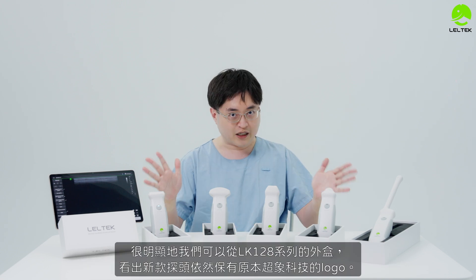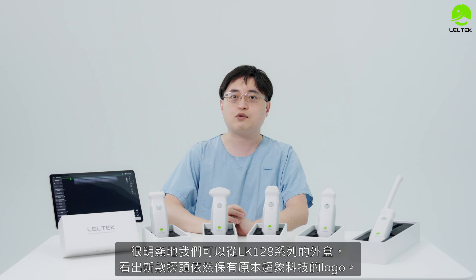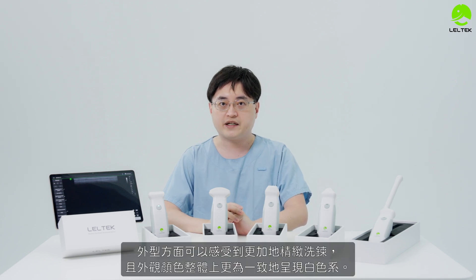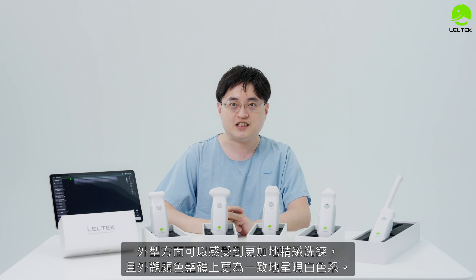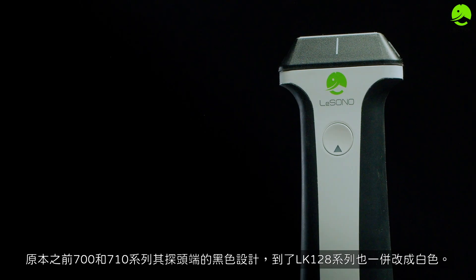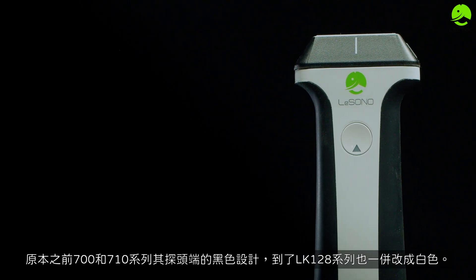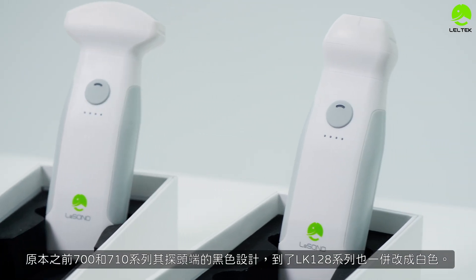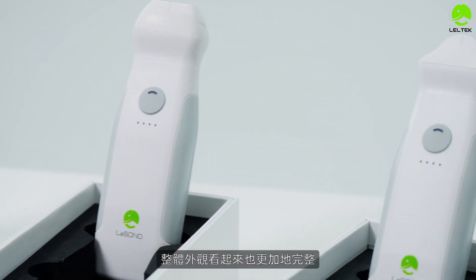The layout and look of the LK-128 series has its own distinct profile. The new frame has a better, more refined layout. The form factor works from both sides, and the overall look — including the white color — is more polished and complete.